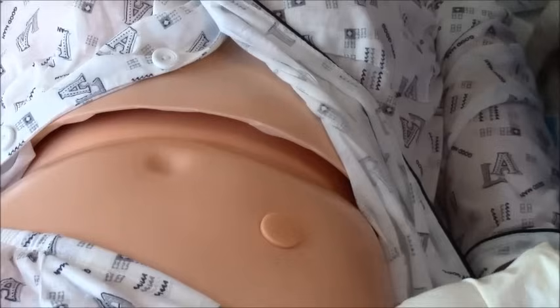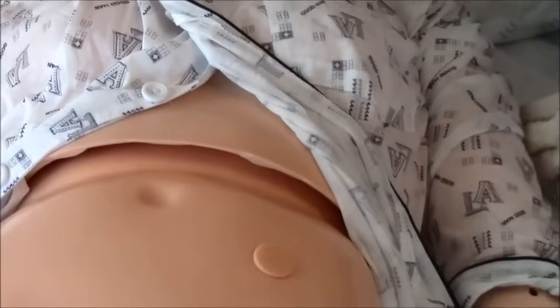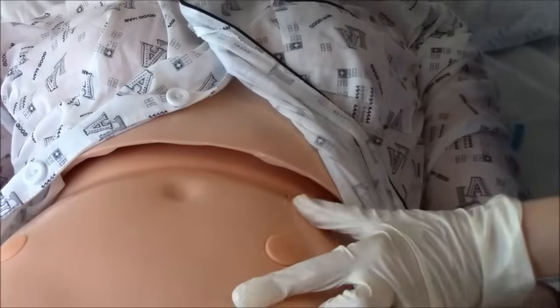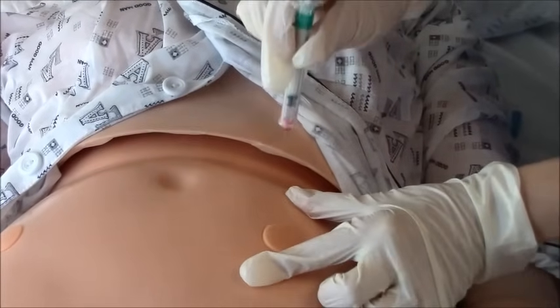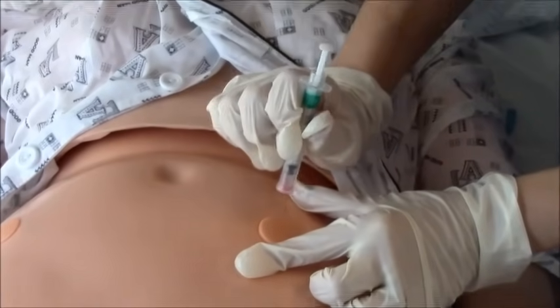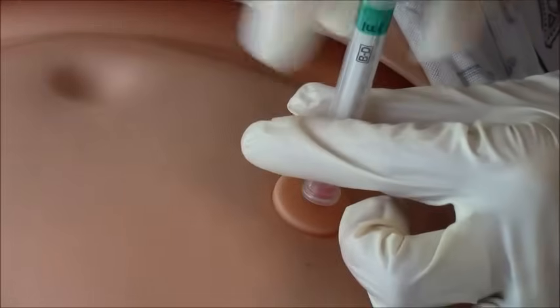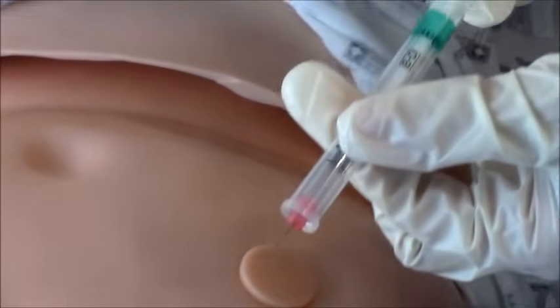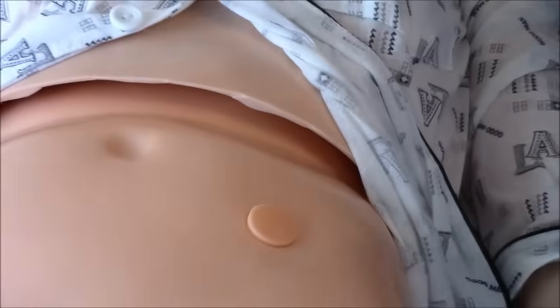We're going to get our syringe and take the cap off. You're just going to pinch the fat of the skin, and you're going to go in at a 90 degree angle, like you're throwing a dart. No need to aspirate, like you do with the IM injection — just going to give it. Take your needle out, engage the safety, and put it in the sharps.